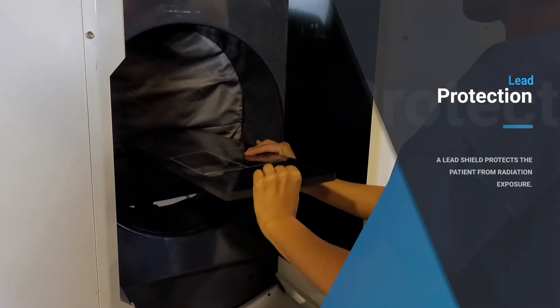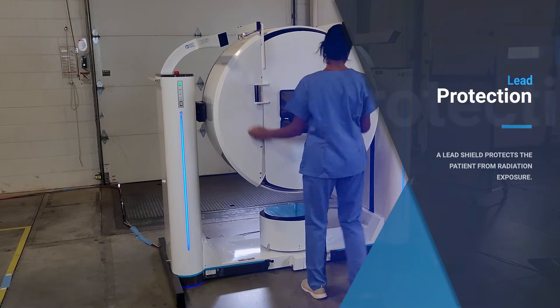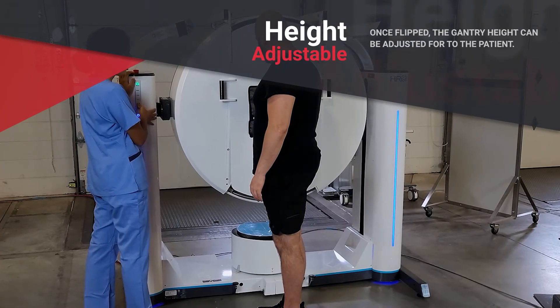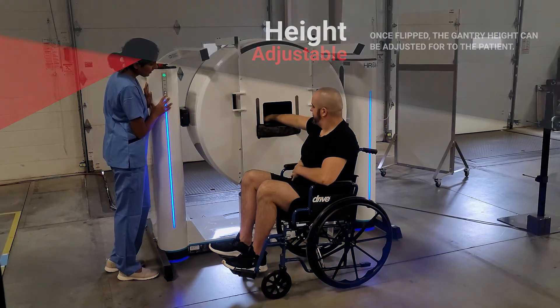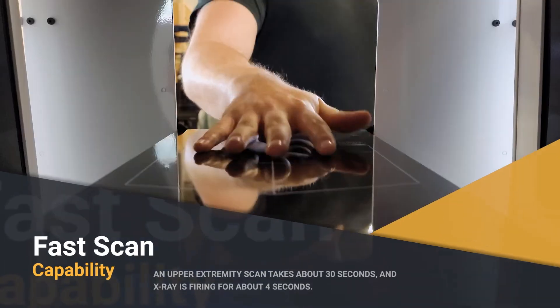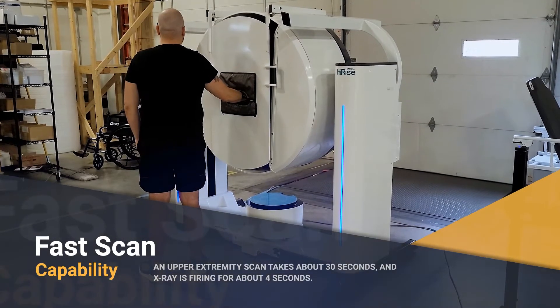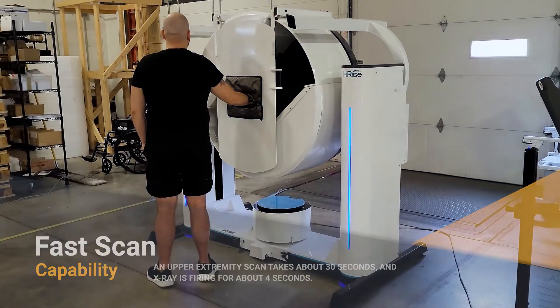A lead shield protects the patient from radiation exposure. Once flipped, the gantry height can be adjusted for the patient. The patient places the region of interest within the field of view border printed on a hand positioner. An upper extremity scan takes about 30 seconds, and x-ray is firing for about four seconds.